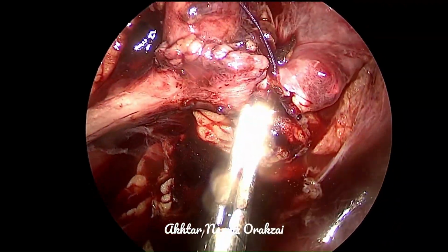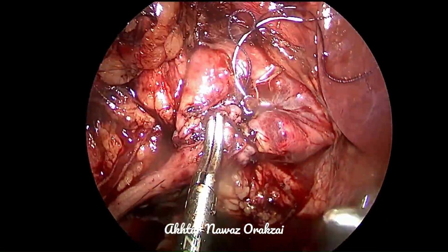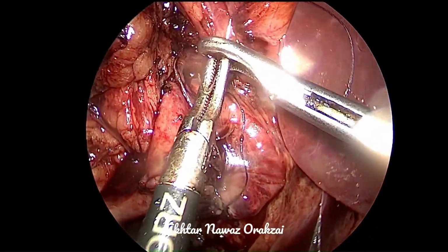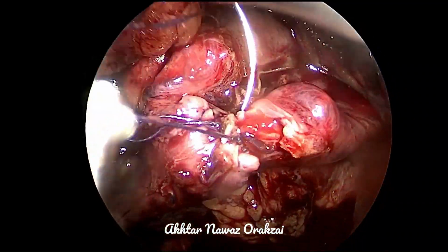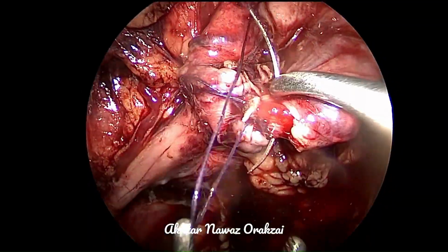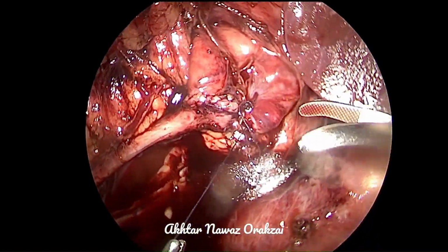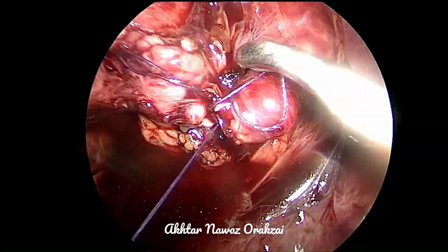So we tie the apex suture so that there is no tension on the rest of the pelvis. So now only a few stitches will be required, and these stitches do not usually need any fine work. It is just opposing the two walls to each other.